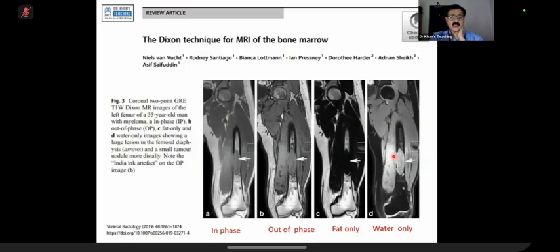But just concentrate on what we call musculoskeletal imaging. In the Dixon technique, and Dixon, I think he died very recently, 2022 or something. He is no more with us. He got some gold medals and things like that for this. So these are 4 sequences which we do in Dixon technique.